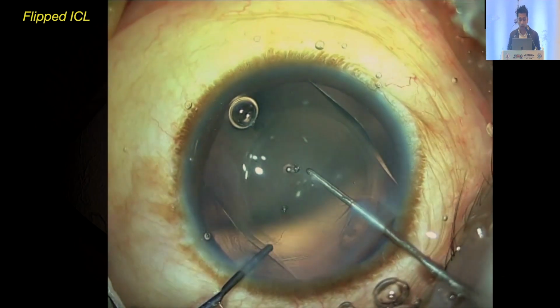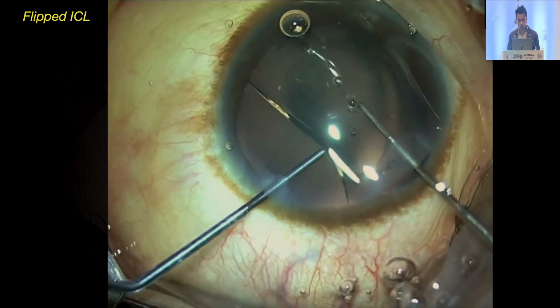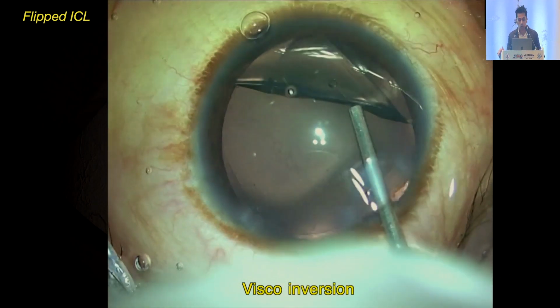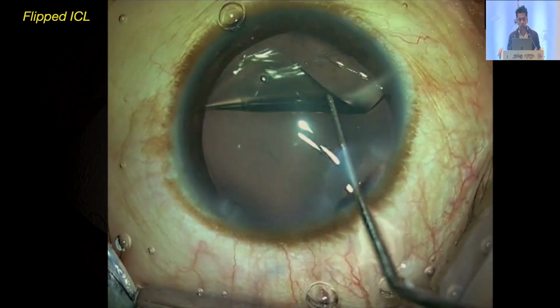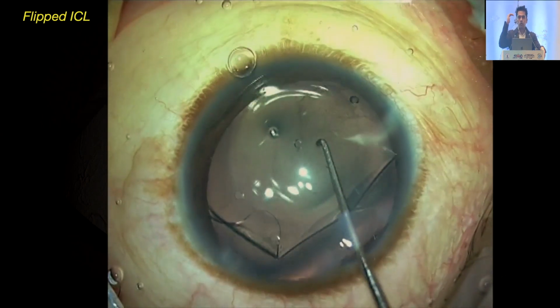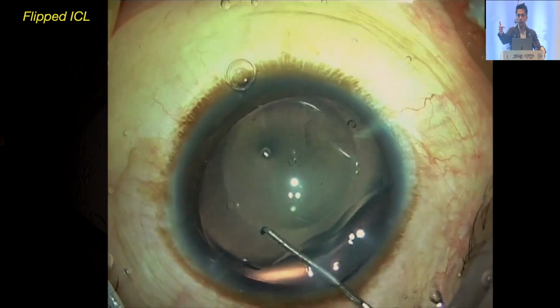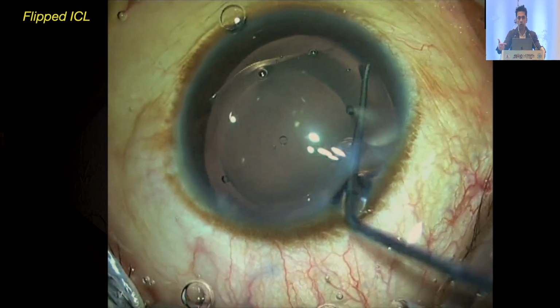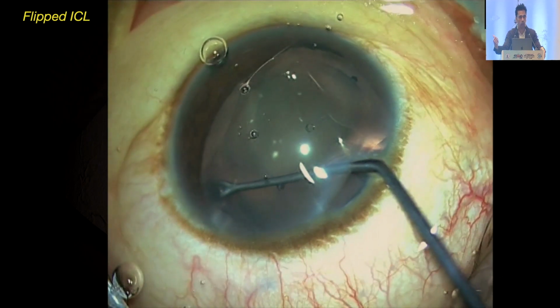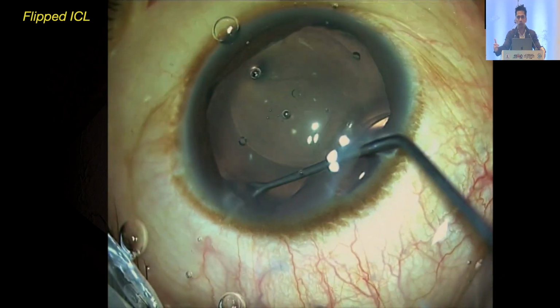And so when you come into a scenario like this, a bimanual visco insertion, so visco inversion technique, is used. You basically fill the chamber with viscoelastic and flip the ICL on one pole into the angle, and that kind of rotates the whole ICL across. We've done at least more than 10 to 12 of these and had absolutely great results.